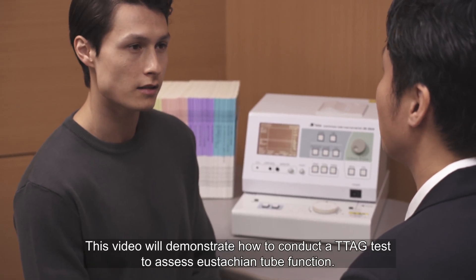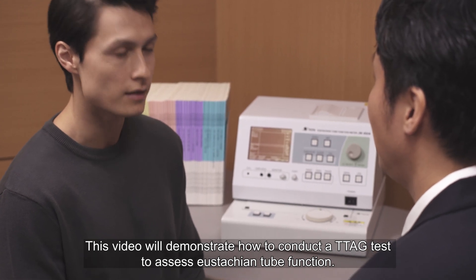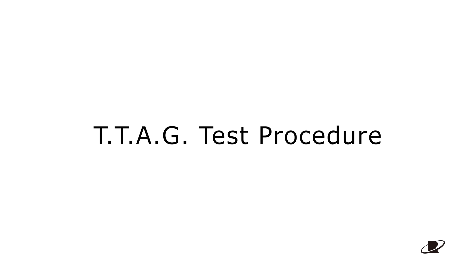This video will demonstrate how to conduct a TTAG test to assess eustachian tube function. Please see the attached instruction manual for how to connect the probes. This section will demonstrate the full test procedure.